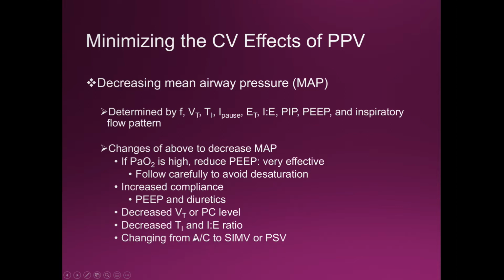I can see that because you do have variances of volumes. Yeah, because the patient can breathe, so therefore it's varying volumes and varying pressures. Now here it doesn't tell me if it's pressure control or volume control.